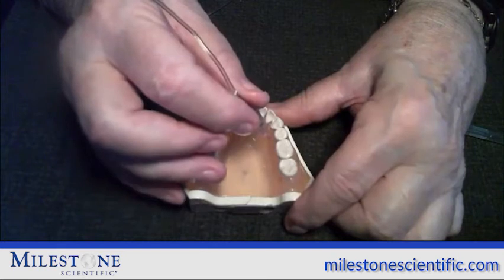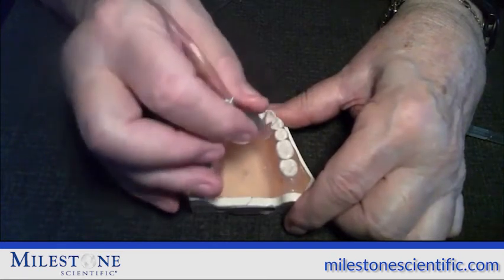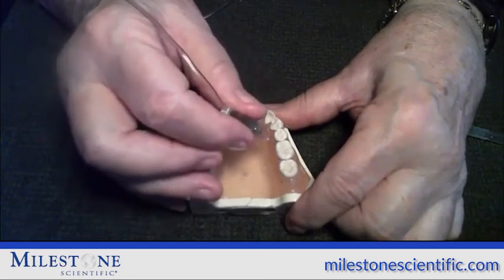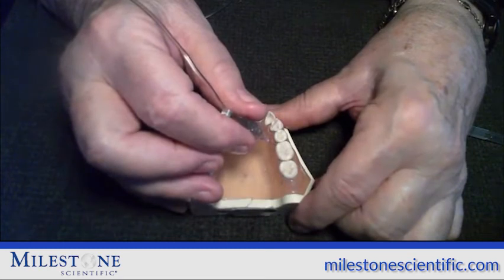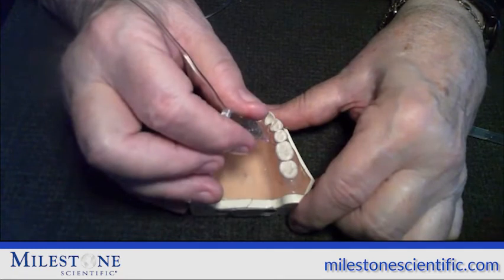So then you go ahead and deliver the rest of the lidocaine, if you're using lidocaine, onto the mesial, the mesiolingual of the first molar, or any tooth except lower incisors, as I said, and deliver the rest of the cartridge of anesthetic. If you're using articaine, then you deliver another 1/4 of a cartridge on the mesial.